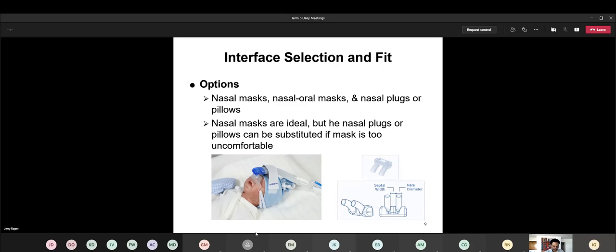And I used to always envy the therapists who could set up their babies and even with a mask, have very, very little leaking. And I struggle with this. I'm not going to lie. Even though I would think I have the right size cap and I would have the right size mask and I Velcroed everything down, tied everything down, and it's still leaking a lot.